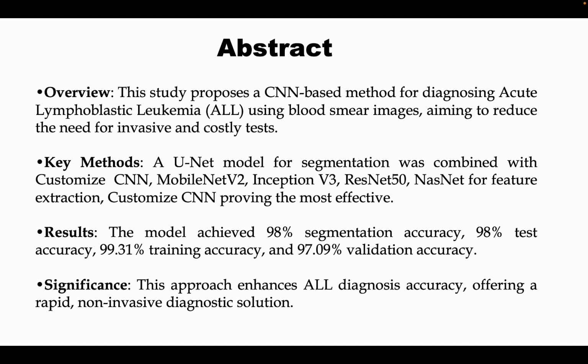This study aims to address the challenges in diagnosing ALL by proposing a novel approach using convolutional neural networks and UNet models. The goal is to enhance accuracy, reduce dependency on invasive procedures, and provide a faster diagnostic solution.